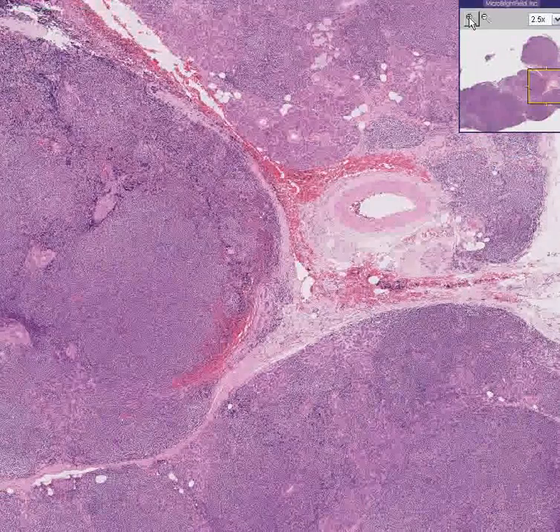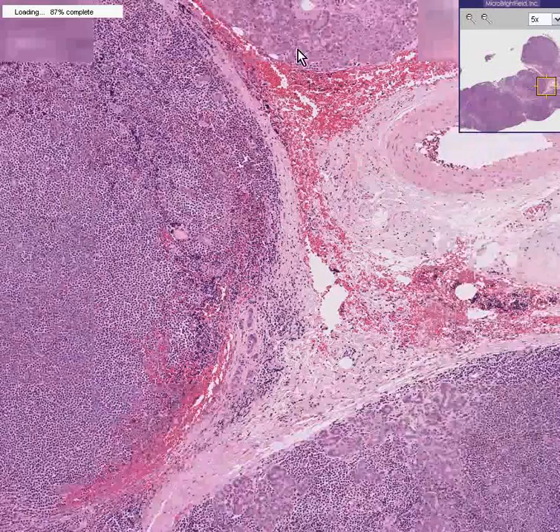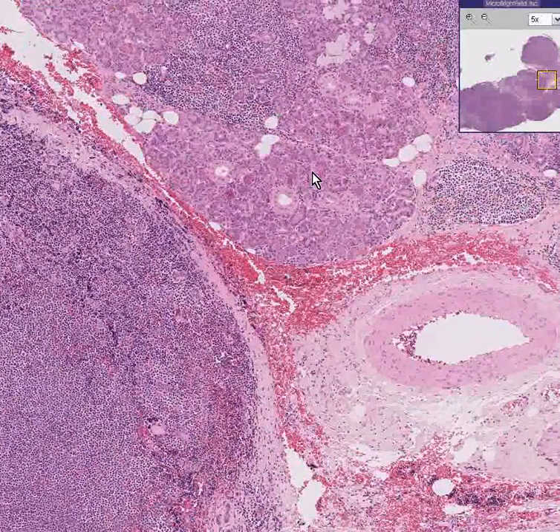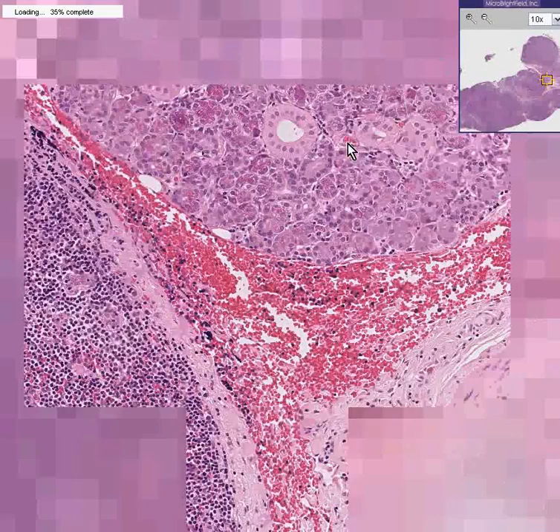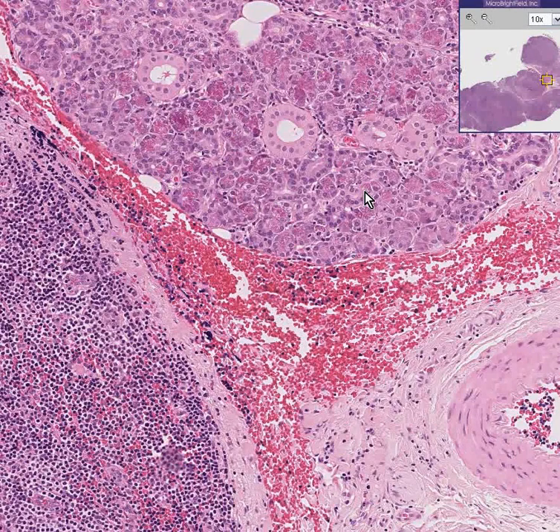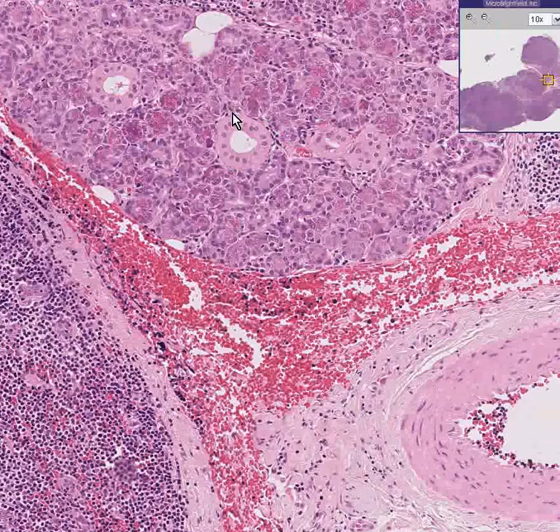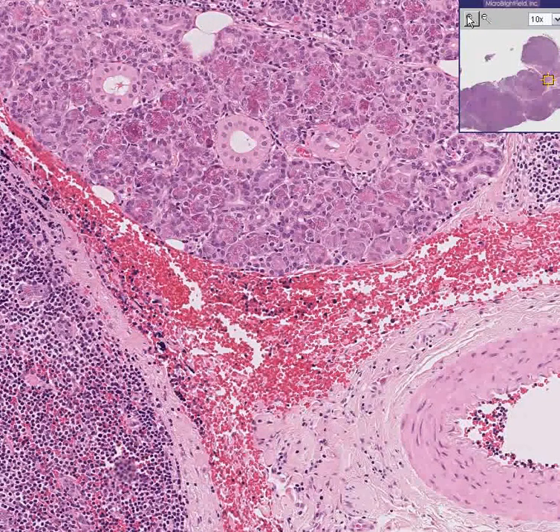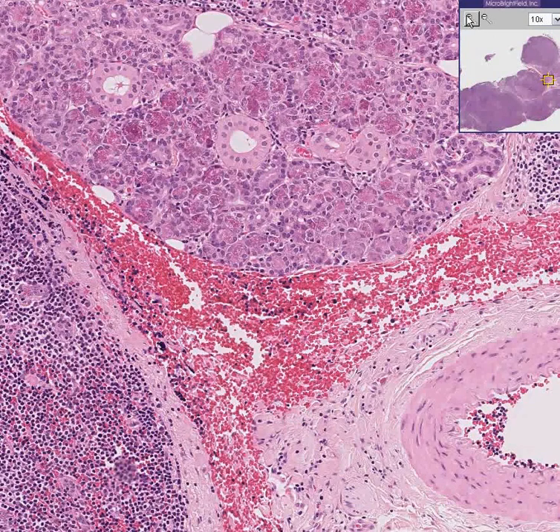Can we recognize some salivary gland tissue here? Yes, we can. We can finally see that this is a salivary gland because we have acini, which look predominantly serous. And we can see large intercalated ducts — they look intralobular. Now we know where this lymphoma was from: it was from the salivary gland region. Thank you very much.